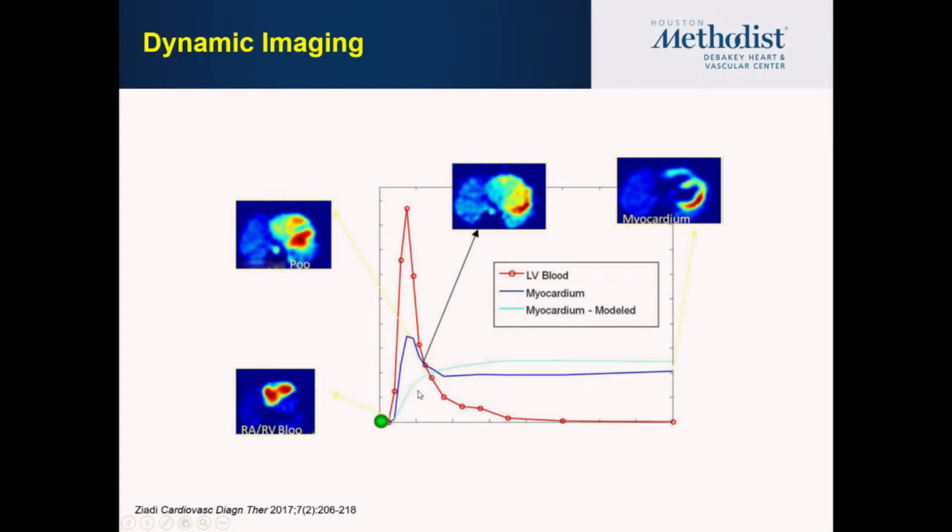The second one is here, this light blue is the myocardium, where you see the myocardium actually is having the radiotracer sitting in the myocardium.